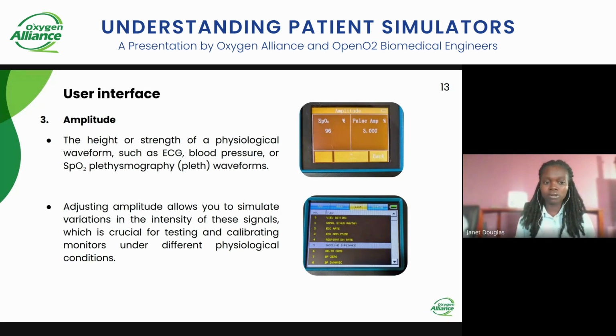it means your monitoring device is working properly. This comes in because you have some patients who have very serious conditions, and other patients whose conditions are not that serious, or maybe their body is actually working normally. And if the device is not able to compensate in all those conditions, then there's something wrong with your monitoring device or even the simulator itself.